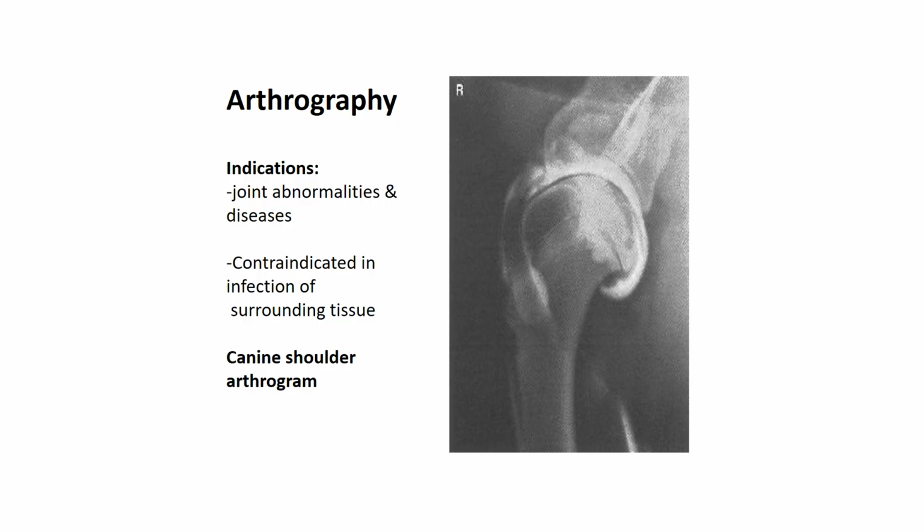So this is a very specialized procedure. Always take care that no infection enters the joint.